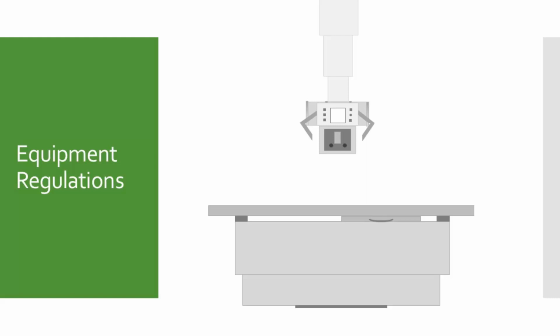Many radiography units have other safety controls that are not required but help to keep the patient and technologist safe. For example, many systems have automatic collimation that closes the collimation shutters to match the size of the cassette that was placed into the bucky.